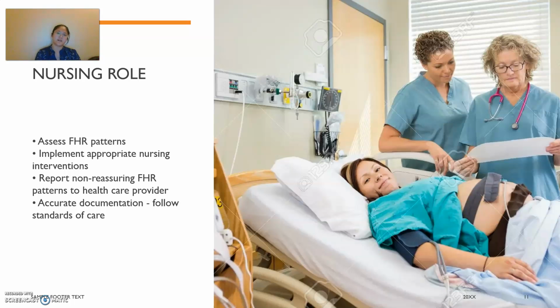So what is the nursing role in this process? You have to assess the fetal heart rate pattern, implement appropriate nursing interventions, report a non-reassuring fetal heart rate pattern to the healthcare provider, and document accurately following the standards of care. No CNA or LPN is allowed to do this process. You can do that with the doctor and the healthcare provider.